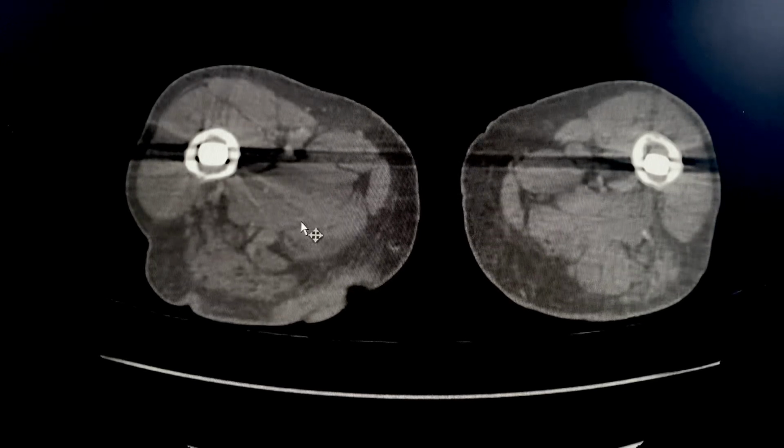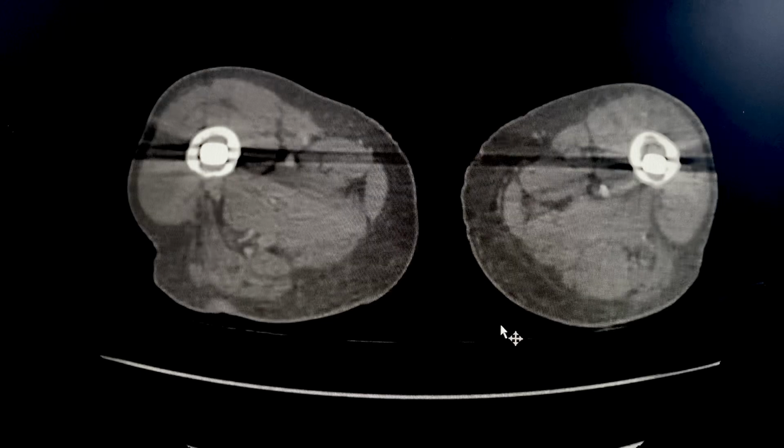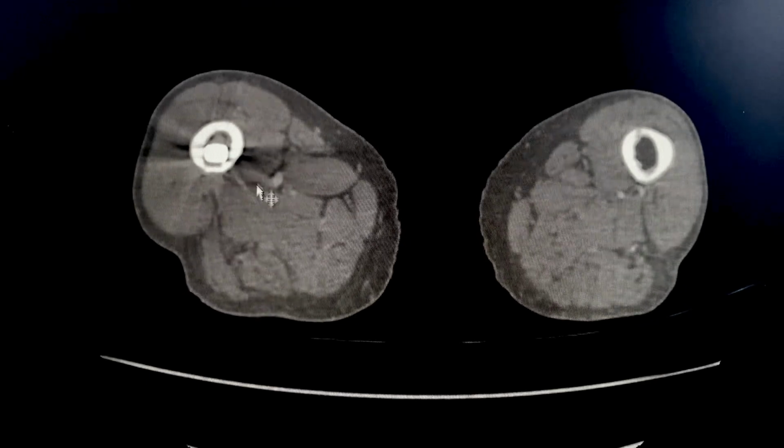And stage 4 is when the patient has trophic changes of the lower limbs. Our patient has no trophic changes, simply atherosclerotic changes, symptomatic occlusion of the common femoral and superficial femoral arteries, and as you can see here, the superficial femoral is clogged.